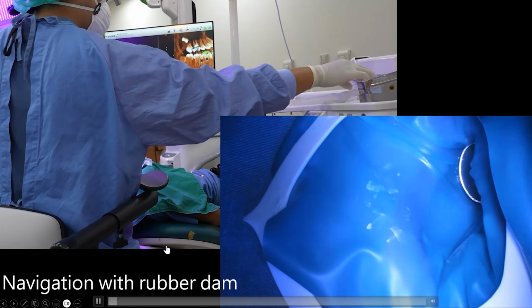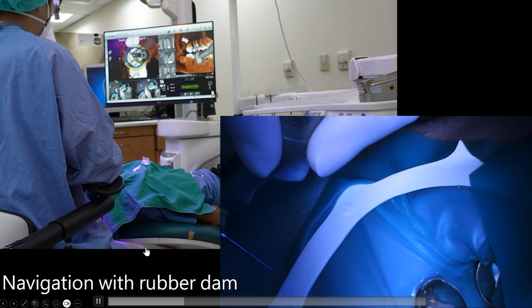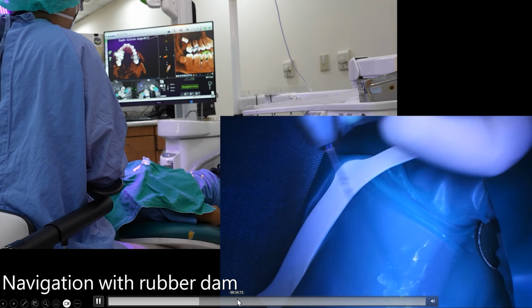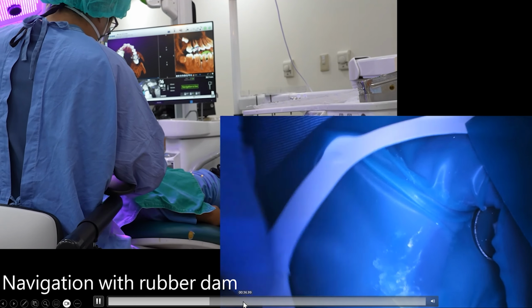It's easier to use this. Okay, but I'm not going to run all over this video. This shows that if you touch some tracker of your navigation system, it moves and you have to recalibrate. But you can just remove part of the rubber dam and try to redo the registration here. Okay? If anyone has a question, I can answer that.